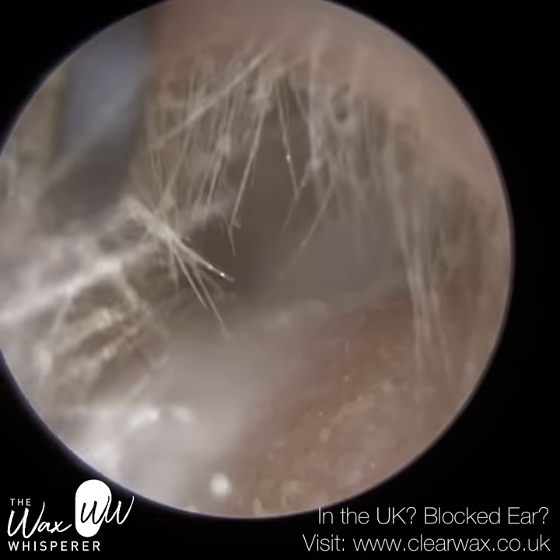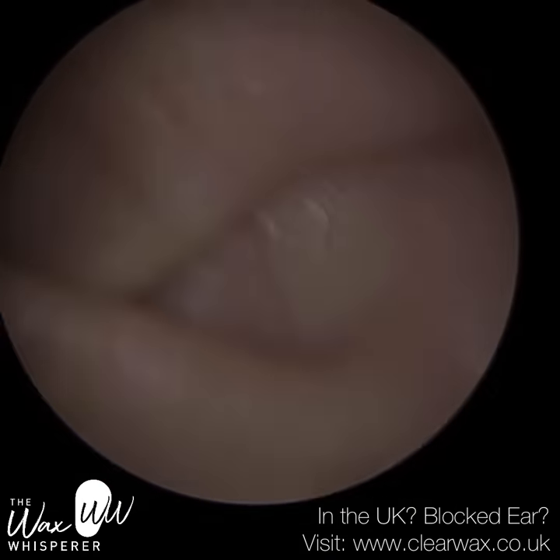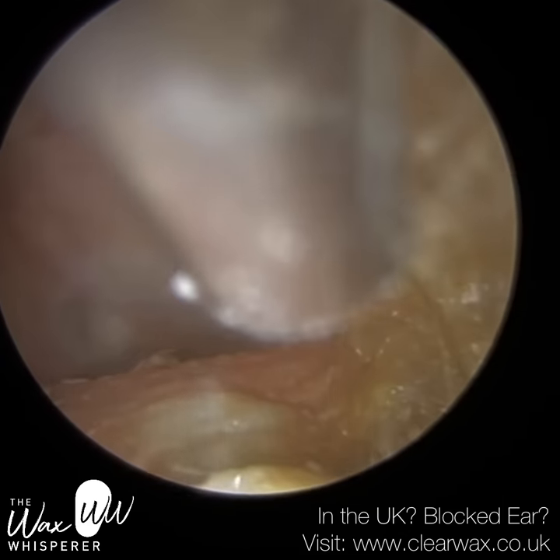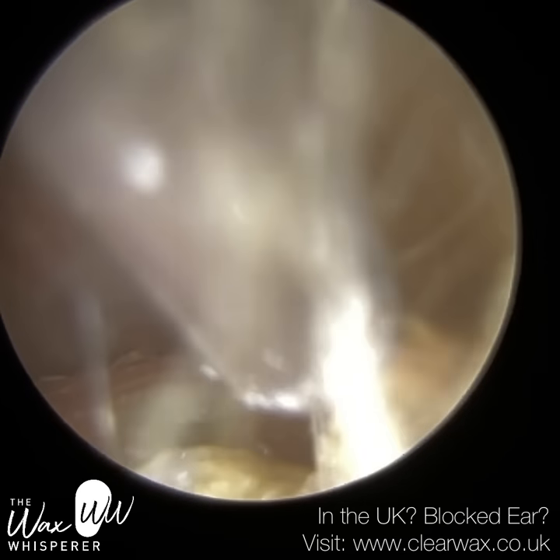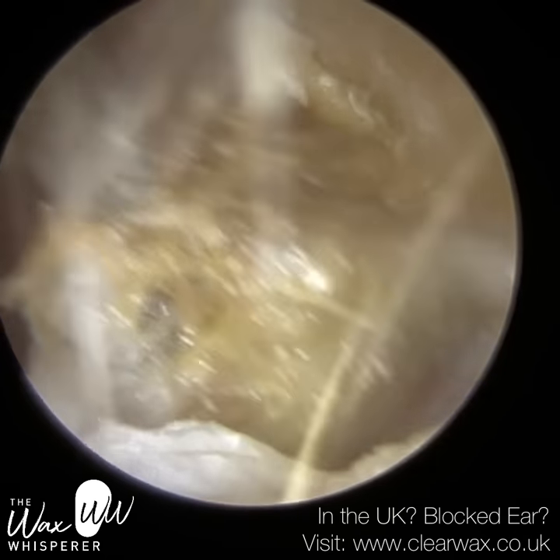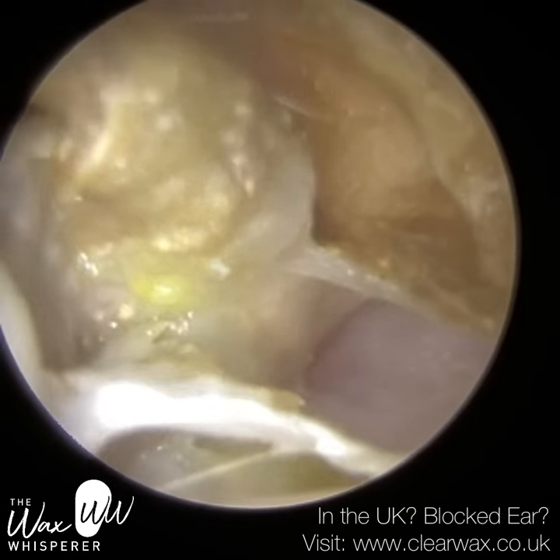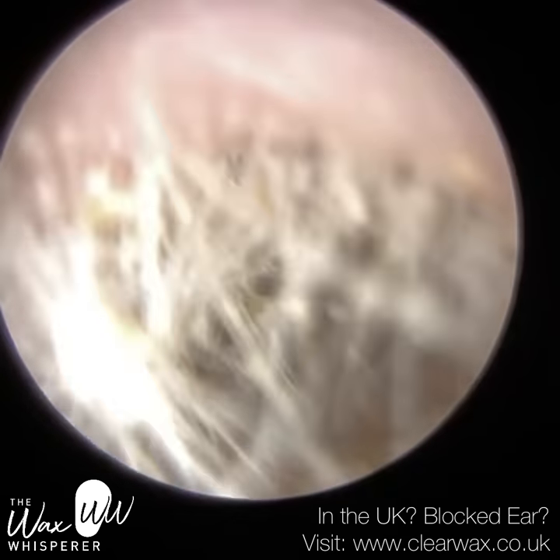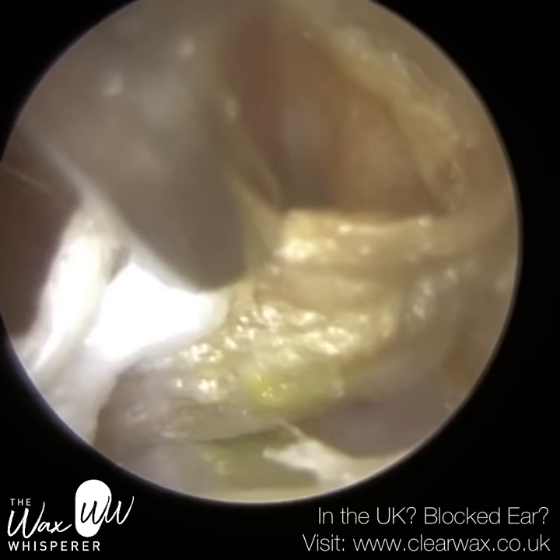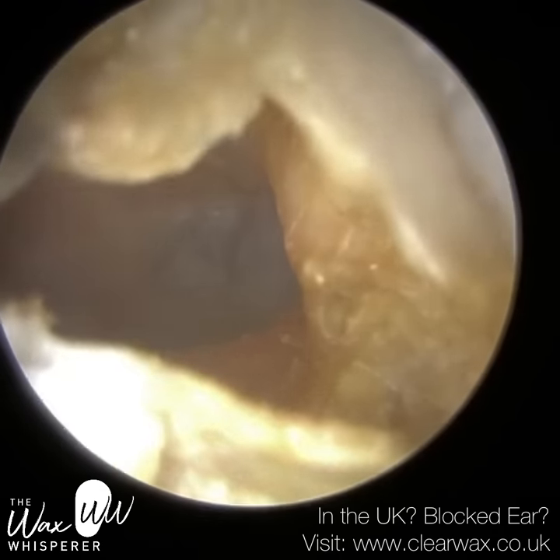It was very apparent, upon examining the ear, that the patient had been getting water inside, and this skin had macerated. Our skin is hydrophilic, so it's attracted by water and it absorbs water. However, if it over-absorbs water — if you've got water in your ear and you're allowing it to soak — the skin absorbs the water, it over-hydrates, which causes the skin cells to burst from the membranes. That results in macerated, very soft, mushy skin, and that provides the perfect breeding ground for bacteria and fungi to incubate and colonise the inside of the ear.